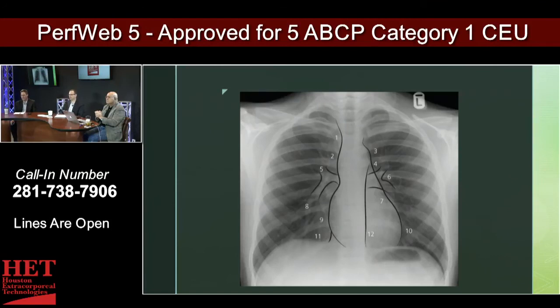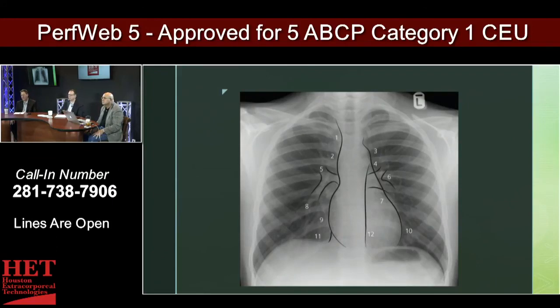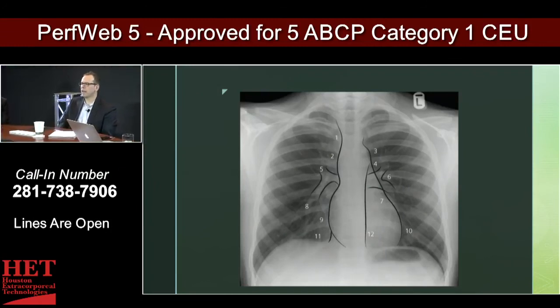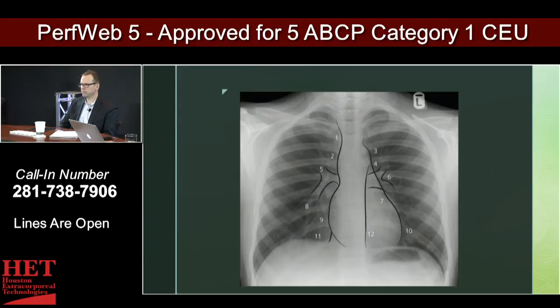Number one is the SVC going down into two, where the ascending aorta comes across. Three is the knob of the aorta — the arch where the left subclavian comes off, the area we look at for the balloon pump. Four is where the pulmonary veins are behind there — also the AP window where the PA curves across to the left. Five and six are your pulmonary arteries. Seven is the heart — more specifically the left atrium and left ventricle area. Eight is down into the sub-lobar branches. Nine is the right lateral heart border. Ten is the left lateral heart border. Eleven is the diaphragm and IVC region. Twelve is the descending thoracic aorta behind there, with the esophagus, and that's also the right ventricle-left ventricle area.